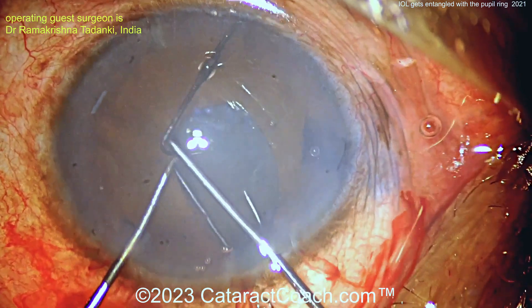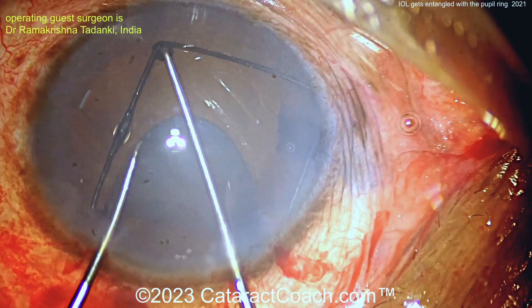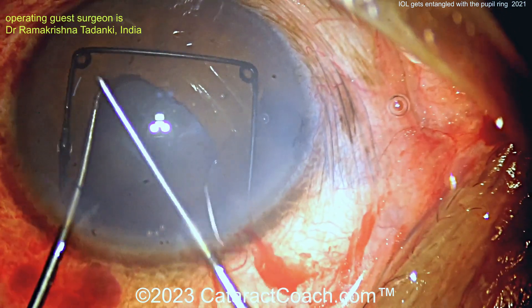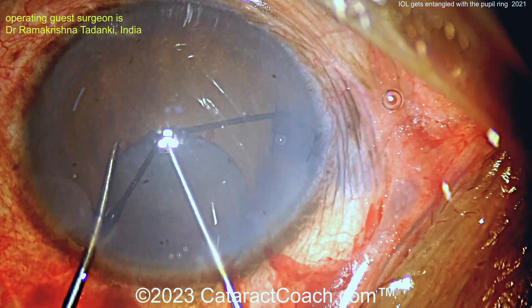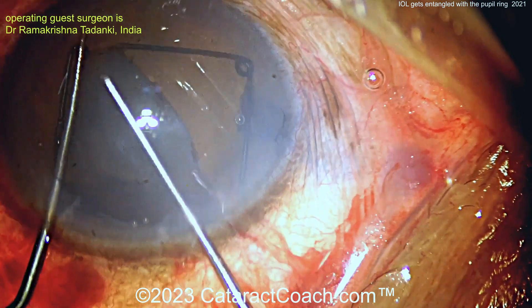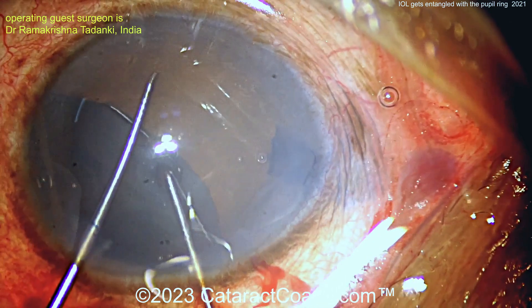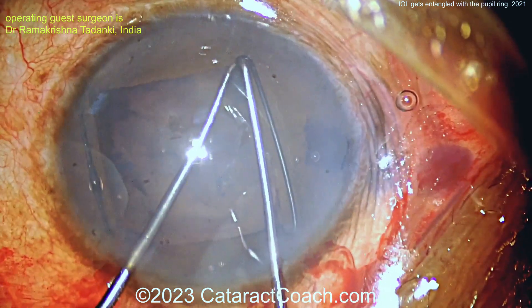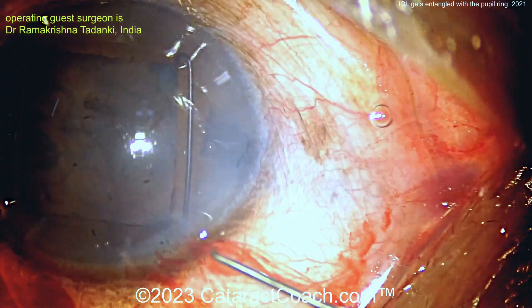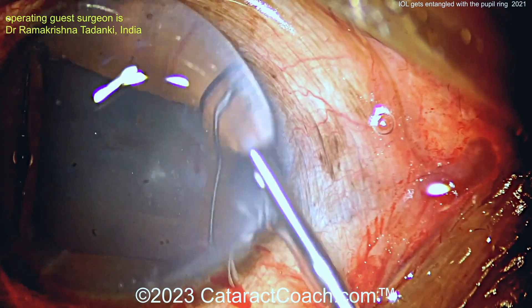There's one, here comes the second scroll. That looks pretty reasonable. Here's the third scroll — that looks pretty good. And then we'll do the fourth scroll. So that's all four scrolls placed. I'm not sure exactly why the patient has such a small pupil — maybe it's an IFIS or Flomax case — but that looks pretty good. The ring's in good position. That's all pretty routine.